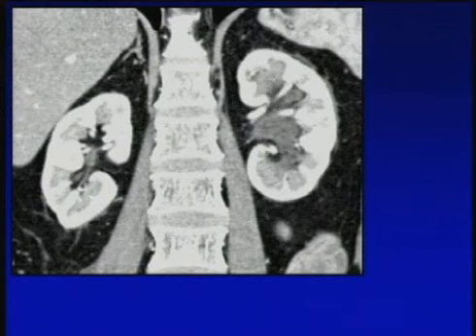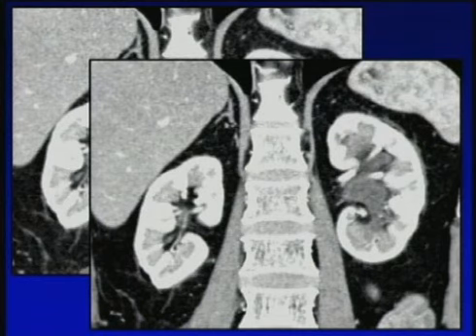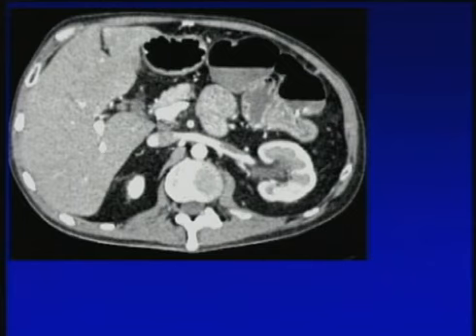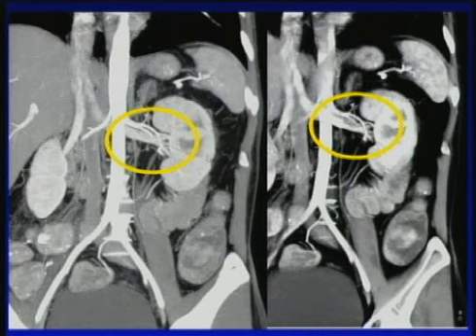And in terms of cortical medullary phase imaging, of course, it's not just arterial changes that have impact. In this case, we see subtle changes. The left kidney is a bit larger. The enhancement is not as intense as the right kidney. The cortical medullary interface is there, but it's relatively poorly defined. And when you look a bit more carefully, this patient had a partial thrombosis of the left renal vein, seen nicely there, and seen nicely there on the 3D reconstructions. So again, vascular changes, arterial or venous, will cause changes in the cortical medullary interface.